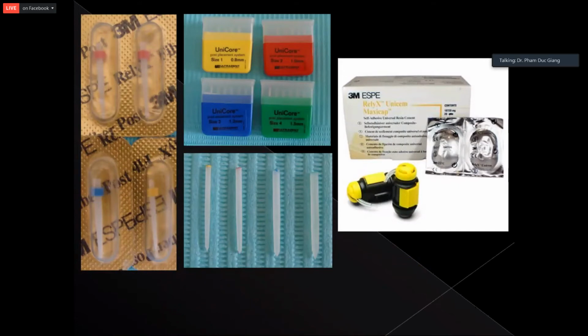Tiếp theo nữa là cái hình ảnh đây là một vài cái ví dụ minh họa của rất nhiều các loại chốt trên thị trường, và bên cạnh đấy là những cái loại xi măng được sử dụng, cái loại mà keo dán được sử dụng đi cùng với lại những loại chốt này.